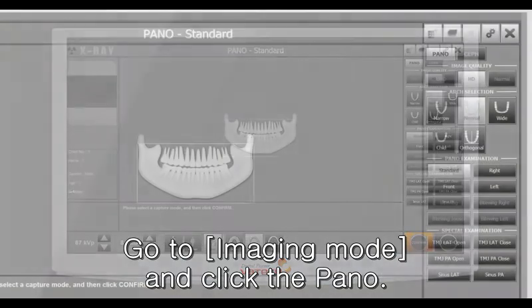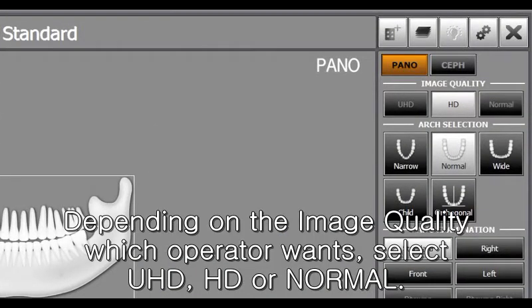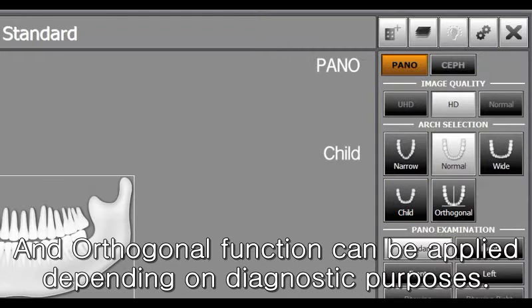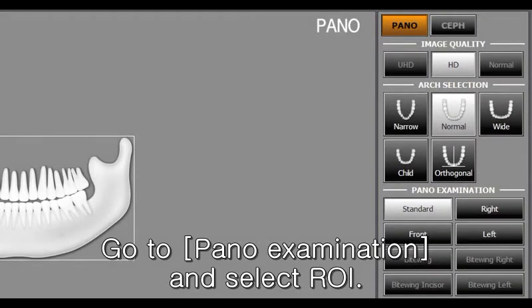Go to Imaging Mode and click the Pano. Depending on the image quality which operator wants, select UHD, HD, or Normal. Select the patient's arch type on the arch selection. There are 4 different arch types: narrow, normal, wide, and child, and orthogonal function can be applied depending on diagnostic purposes. Go to Pano Examination and select ROI.